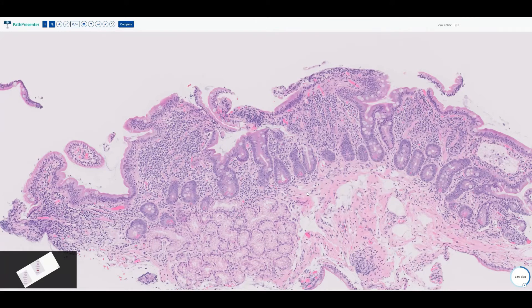Celiac disease — do not write it on your top line. That is something made clinically. All we can tell them is that we see intraepithelial lymphocytes, we see villus blunting, and we see increased lymphoplasmacytic lamina propria inflammation. All three together is very supportive of celiac disease.